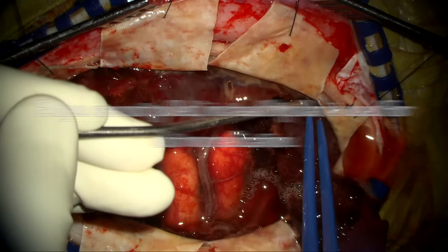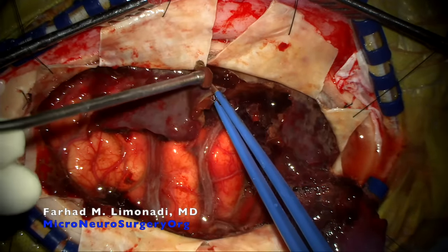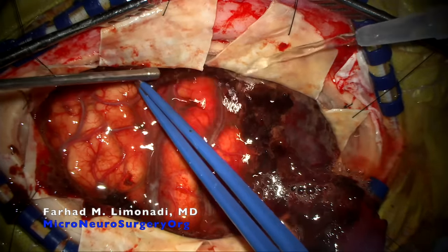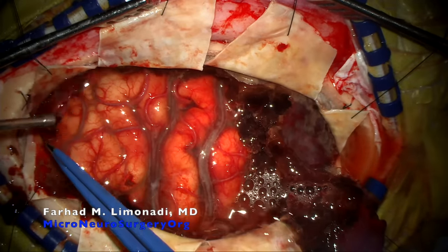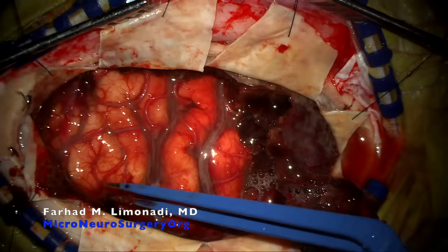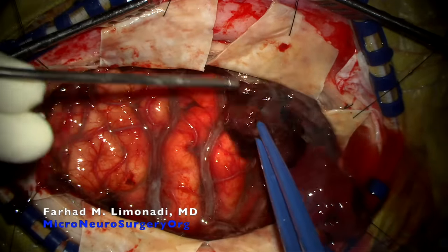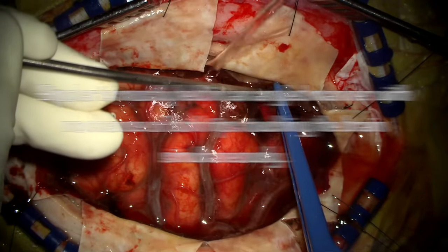Please note that the edges of the clot are never pulled or tugged on impatiently. Instead, bipolar is used to morselize the exposed edges. Here, with the aid of a surgical assistant irrigating, hydrodissection, bipolar morselization, and suction are carried on simultaneously to retrieve clots. Bipolar is mostly held at an angle to avoid both tips touching the brain.